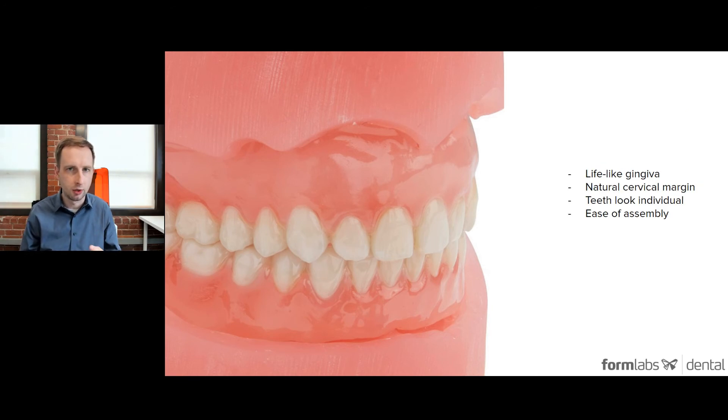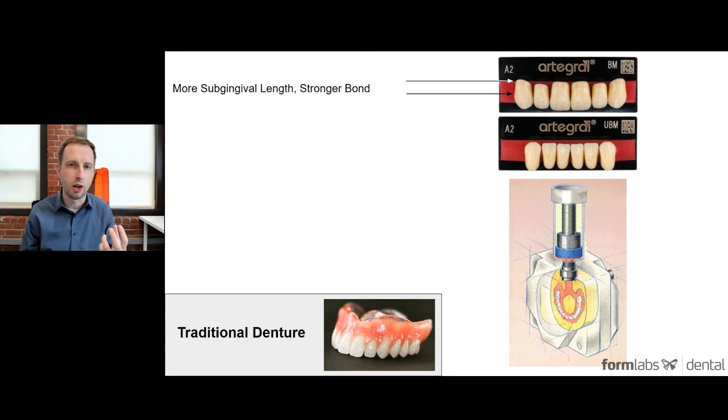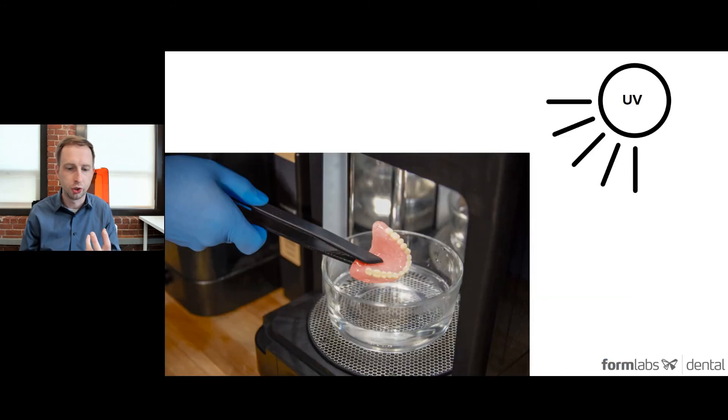Those are the four main features and steps to consider when assembling and creating 3D printed dentures. Traditional dentures — when using flasks and injecting or packing acrylic — typically meant shorter teeth equaled lower strength, since a longer tooth in the base created a more mechanical bond between the two materials. But this 3D printed workflow is counterintuitive: after assembly, when you UV cure the parts 30 minutes on one side, flip and 30 more minutes for a total of one hour, the base and teeth actually become one solid part. The root length of the teeth has no bearing on the overall strength of the prosthetic.